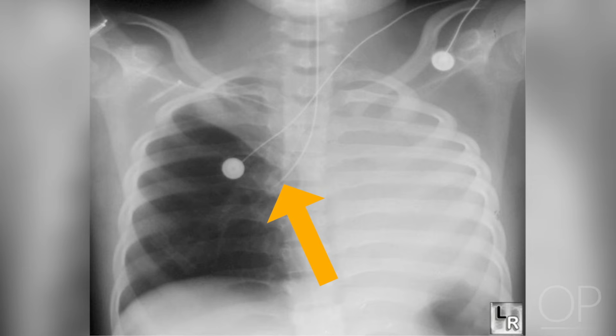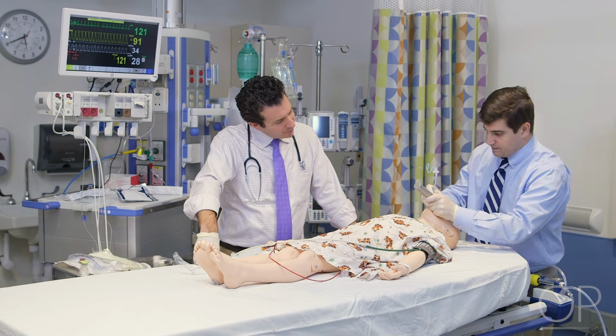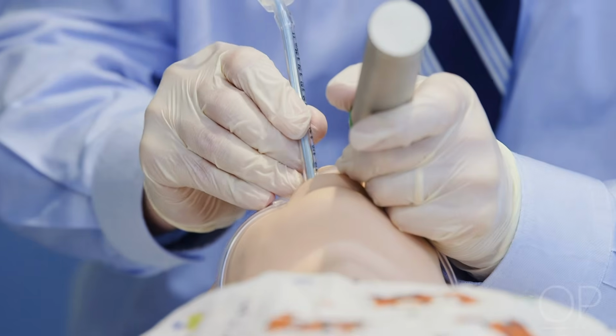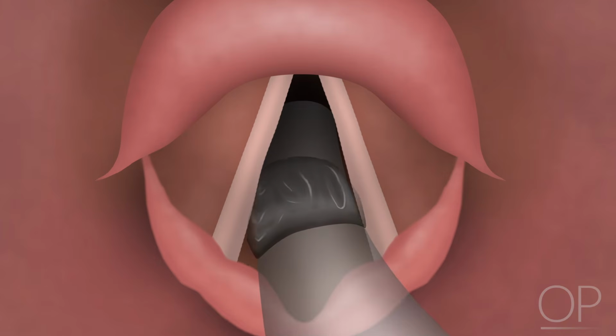Right mainstem intubation. Advancing the endotracheal tube too far into the trachea will result in a bronchial intubation. Consideration of the appropriate insertion depth during the intubation plan can be helpful. Tubes may be marked or taped ahead of time as a visual cue. During the procedure, the depth of insertion should be guided by the lines on the endotracheal tube or until the cuff is visualized to just past the vocal cords.